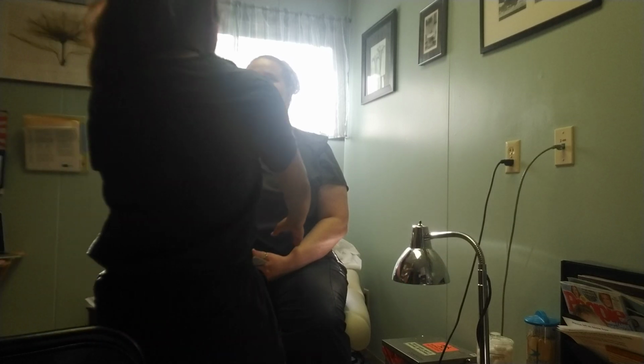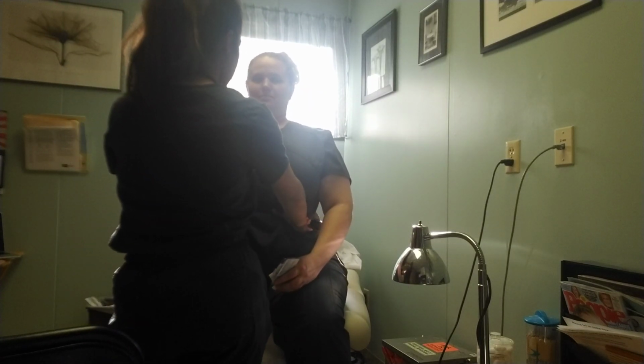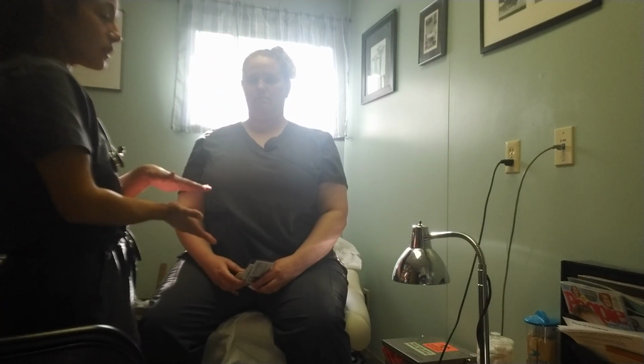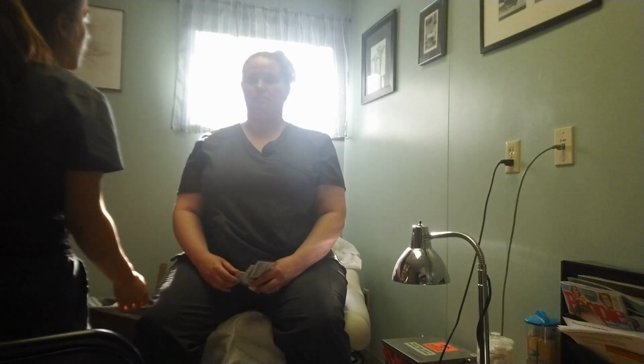Alrighty, so I'm sorry. Alright, I'm gonna get underneath here. And I'm gonna have you take a deep breath. And out. Perfect. Her chest expansions, inspiration and expiration are bilateral there.